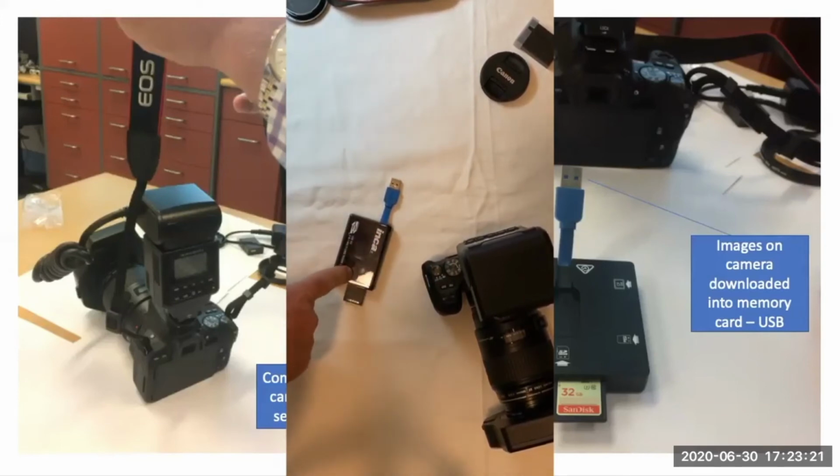I always think it's a good idea to take a photograph of the patient's name before you take the patient's photographs, so that when the person comes to loading this into your practice management software, they know whose clinical images they belong to, and they can easily find the patient's record.